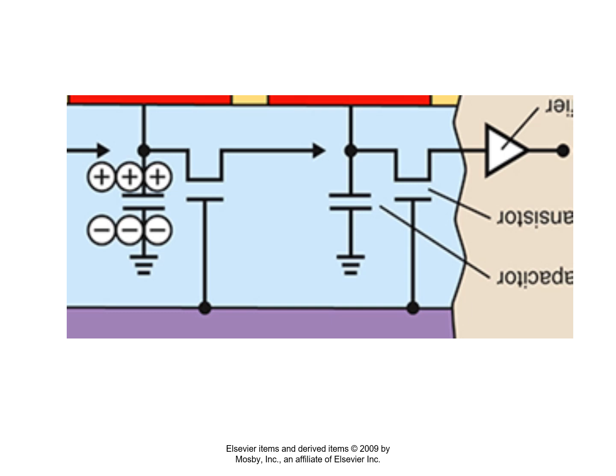And so you can see that the schematic repeats itself after that point. So after we get those positive charges to move to the gate electrode, that's a one-way street. Okay, there should be a diode in there, but it's simplified. Okay, the storage capacitor over to the right in the first row is now empty because it did the same thing, and that ended up dumping the positive charges to the amplifier. So now that storage capacitor is empty.